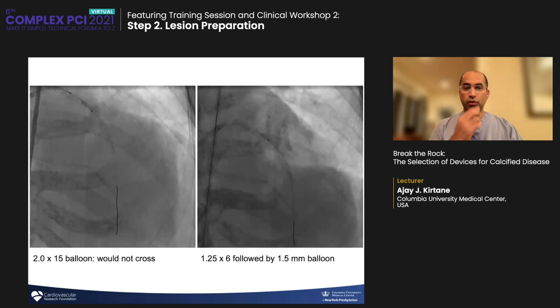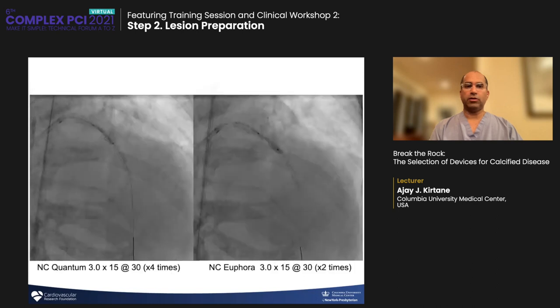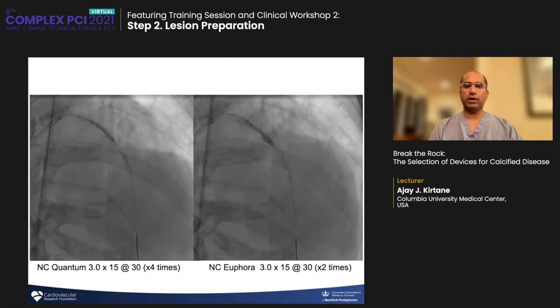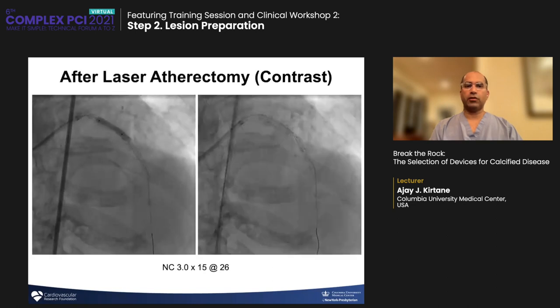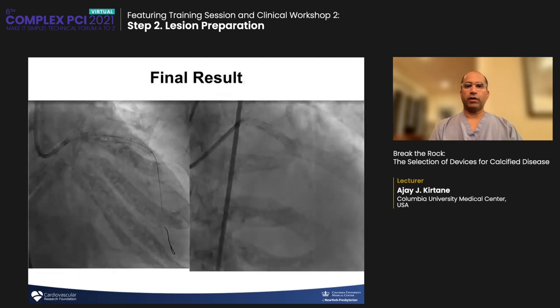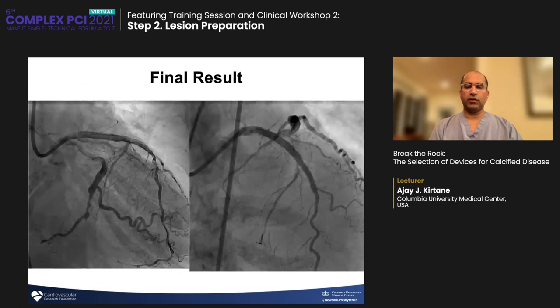We then tried to cross with a 2.0 balloon, that wouldn't cross, and finally a 1.25 balloon and then a 1.5 balloon was able to cross and make a little bit of room. Unfortunately, with NC balloons, we were unable to expand this area despite going up to 30 atmospheres with different companies' balloons, and you can see the remarkable waist there in the proximal LAD, and I'll remind you this had already been rotablated in the past. And so at that point, with an inability to advance the 3.0 balloon past the LAD stent, we opted to proceed with laser atherectomy. And with contrast, this is what we got, demonstrating that the calcium had cracked and we're able to actually expand the prior stents that were there. So the final result that is shown here shows good expansion and the patient has done well since then.